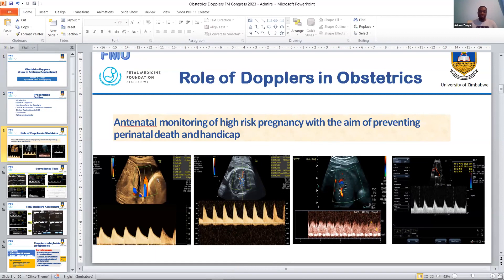The umbilical artery Doppler is usually done in a free loop and should be low resistance if normal. Then the MCA — the middle cerebral artery, shown in the second image — should be high resistance if everything is normal.